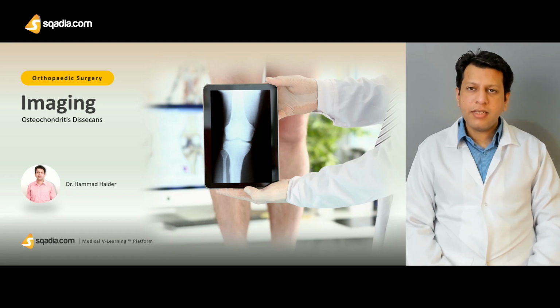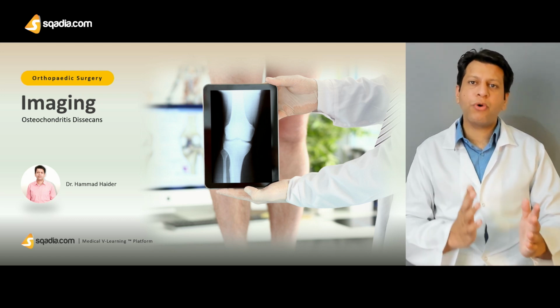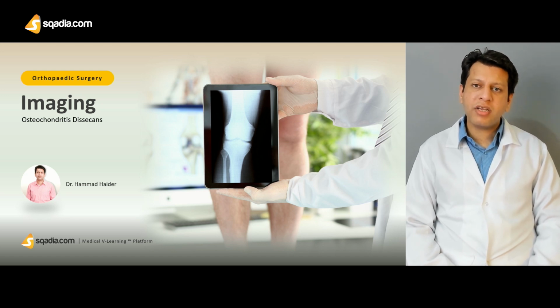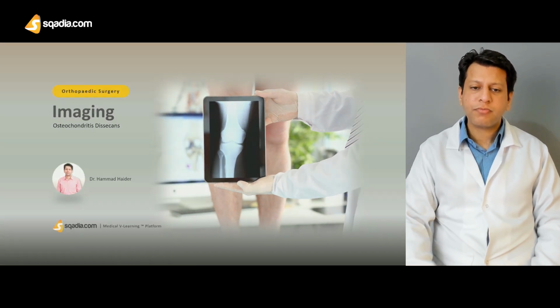Once we've taken a detailed history and examination, and our primary diagnosis points towards Osteochondritis Dissecans, we need to confirm our diagnosis by certain imaging. First and foremost come the X-rays, and we have to get an AP and lateral view of the knee joint while standing. Why are AP and lateral views important?